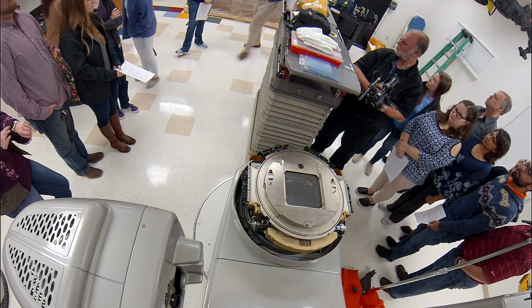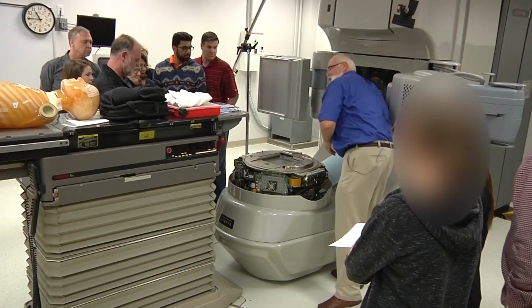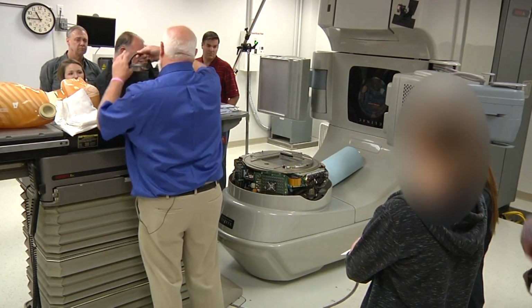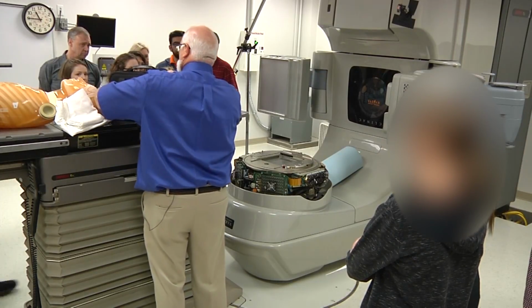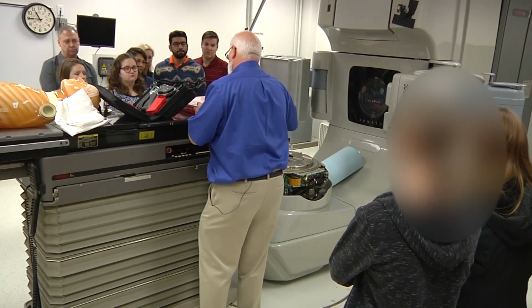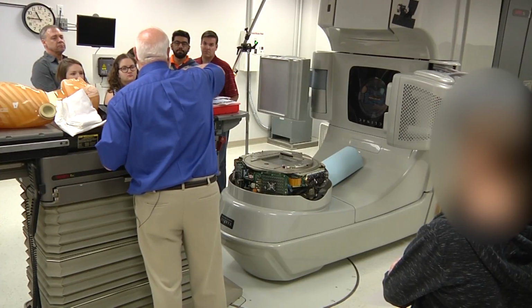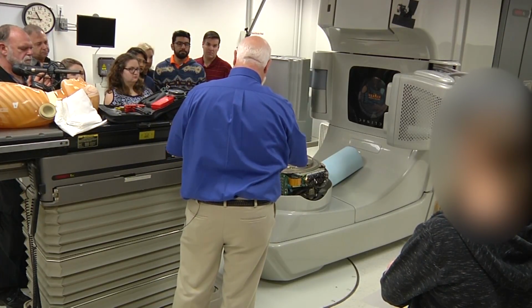piece of your patient setup. So now you know why these might be in a different location, because your service engineer uses them. And usually you'll have a few tools on site. All you need is a set of Allen wrenches for the most part to do service on this.